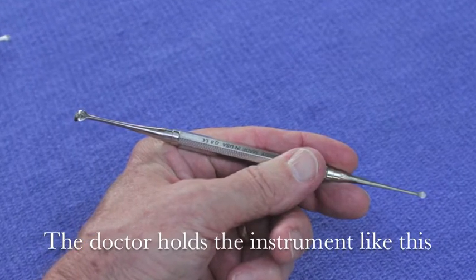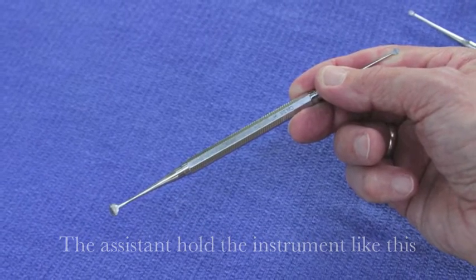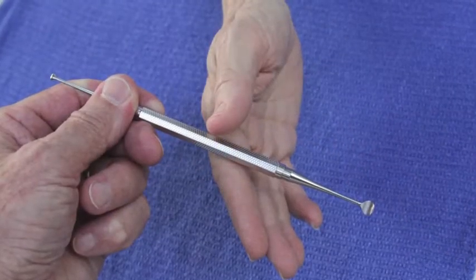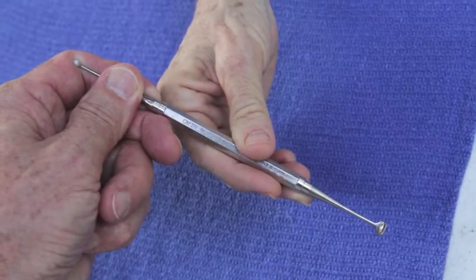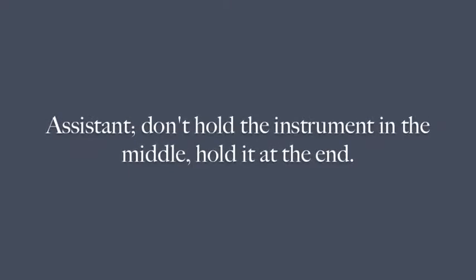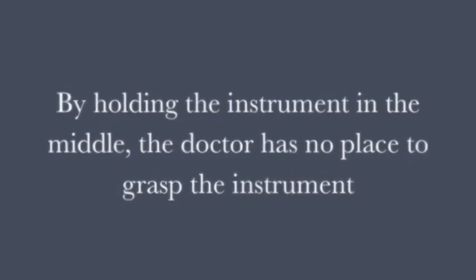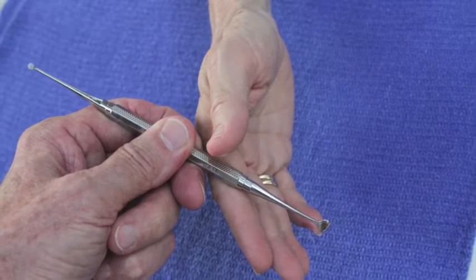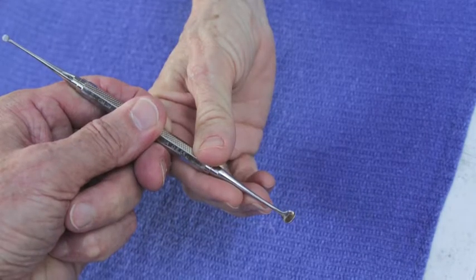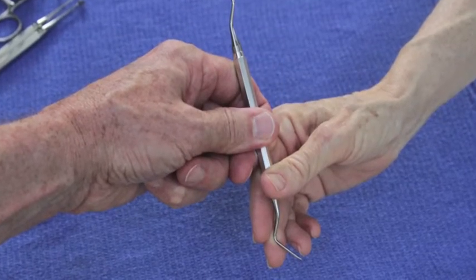In these images, you can see the basic difference between how a dentist will hold the instrument and how a dental assistant will hold the instrument. Be mindful of the way that you hold the instrument, as it will facilitate the doctor being able to grasp the instrument properly and be able to use it. Be careful, do not hold the instrument in the middle, as this will leave the doctor with no place to grasp hold of the instrument for use. As you can see in these images, the dental assistant is holding the instrument in the middle, and the doctor is not able to grab hold of the instrument properly.